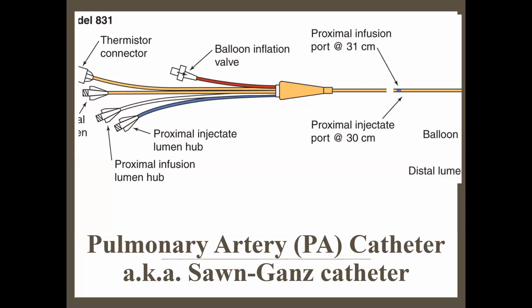Okay, so you're going to hear people abbreviate this to SWAN, but it's a pulmonary artery catheter. It's just like tissues for your nose. There's either Puffs or Kleenex. Those are the brand names. Same concept here. So this is a pulmonary artery catheter, also known as Swan-Ganz. Oh God, she spelled that wrong. S-W-A-N. Move the A and the W. That's backwards. Should be swan, like the bird.